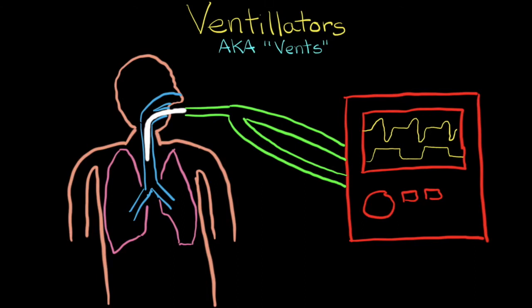And what I mean by that is the cause of the respiratory failure that led to us having to provide the mechanical ventilation support. Let's say it's trauma, it's neurologic, sepsis, whatever the cause of that respiratory failure is, the vent is doing absolutely nothing to fix that problem. It's merely a support device, providing the respiratory support that your patient needs when they're unable to provide for it for themselves.